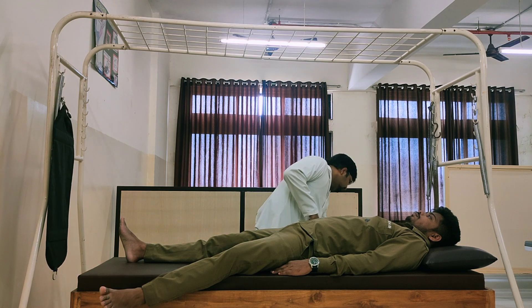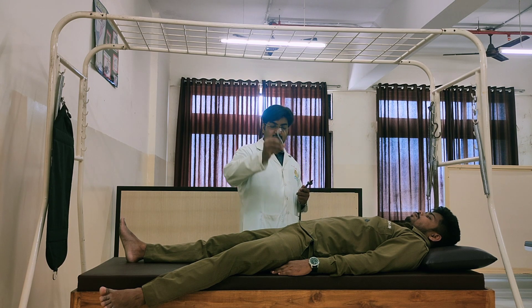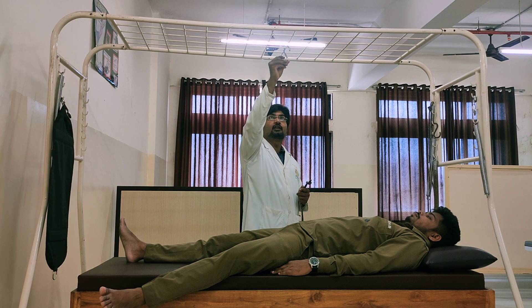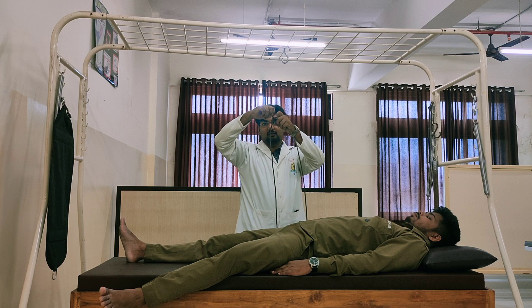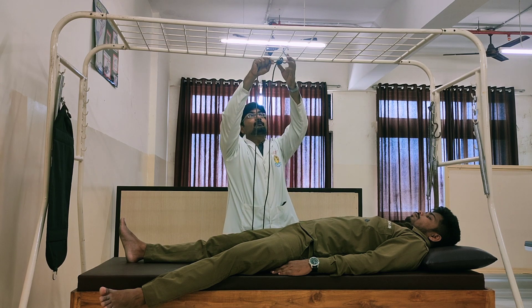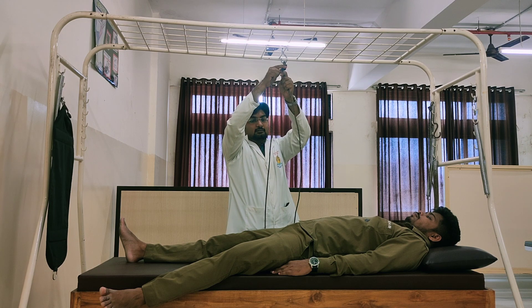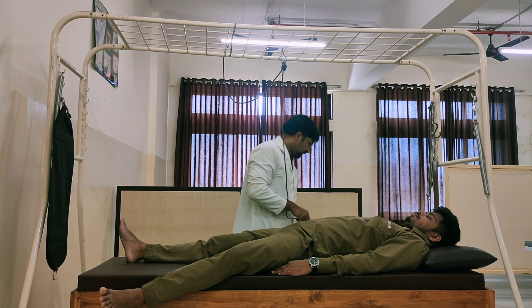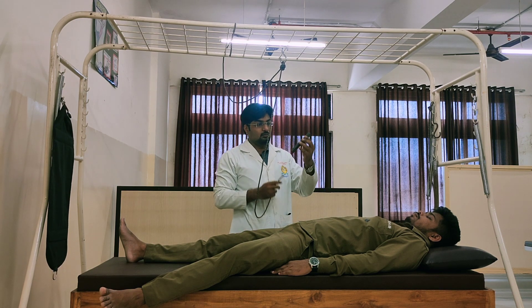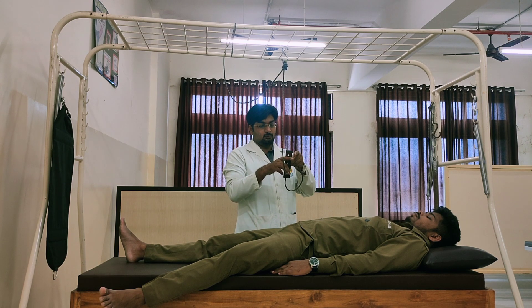First of all, I will use the S-hook. Place the S-hook just above the hip joint. This is a rope — divide the rope into two parts. Here I will tie it to a knot, and then tie the knot onto the S-hook. First we will find the point of suspension, whether it is correct or not. This is the wooden sleeve — just pass the rope through it.